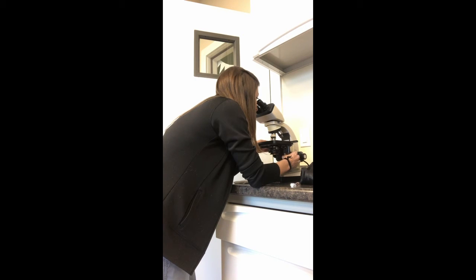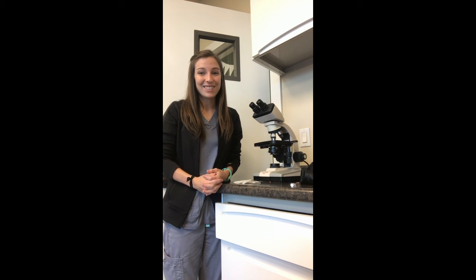I see no other kind of microorganism. I'll look through multiple different areas of my blood sample to determine that there is, in fact, no microfilariae, so this heartworm test is negative.